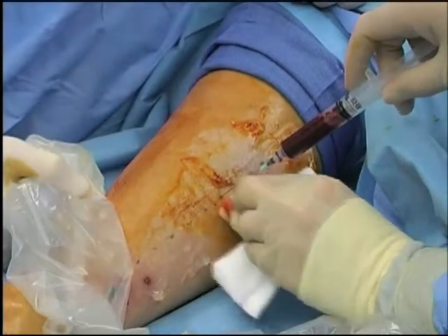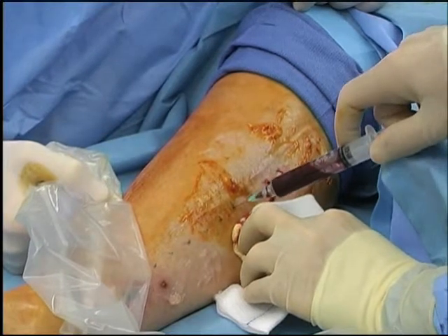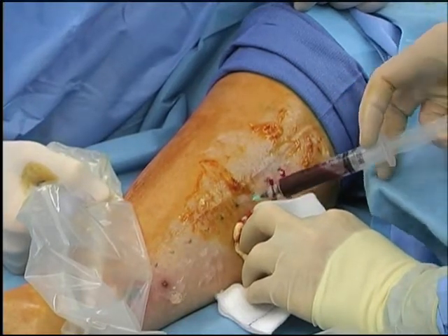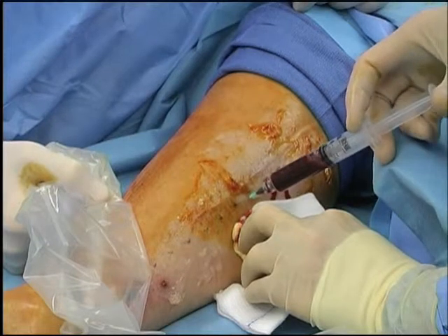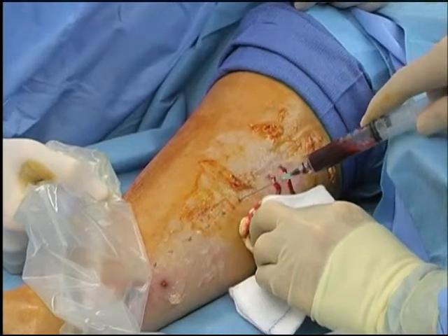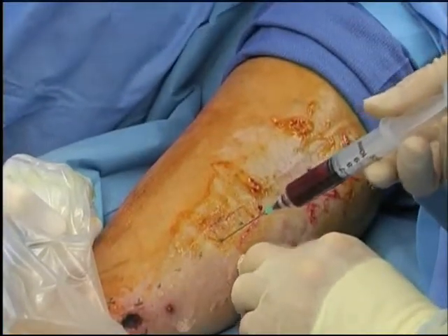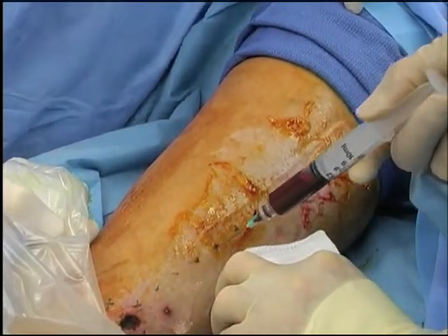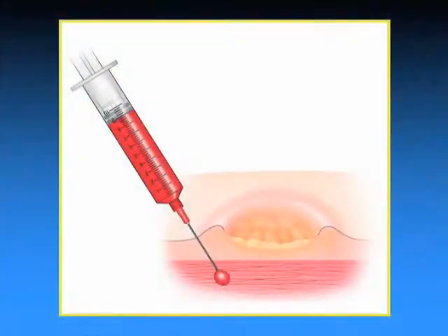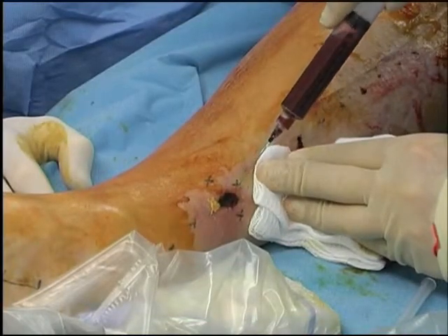Ultrasound guidance is used to localize injections. Although the target areas will typically have occluded arteries, the ultrasound may identify the popliteal or tibial veins, which are always adjacent to the native arteries. To minimize the risk of nerve injury, the injection is placed approximately 5 to 10 millimeters away from the neurovascular bundle. When tissue loss is present, several injections around the perimeter of the wound are indicated. Injections should be spread 1 to 2 centimeters apart.